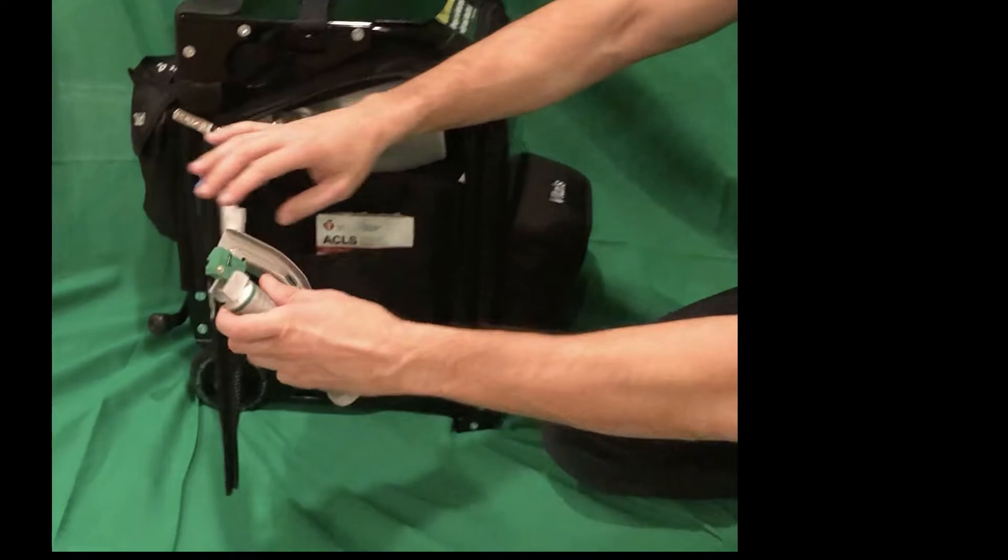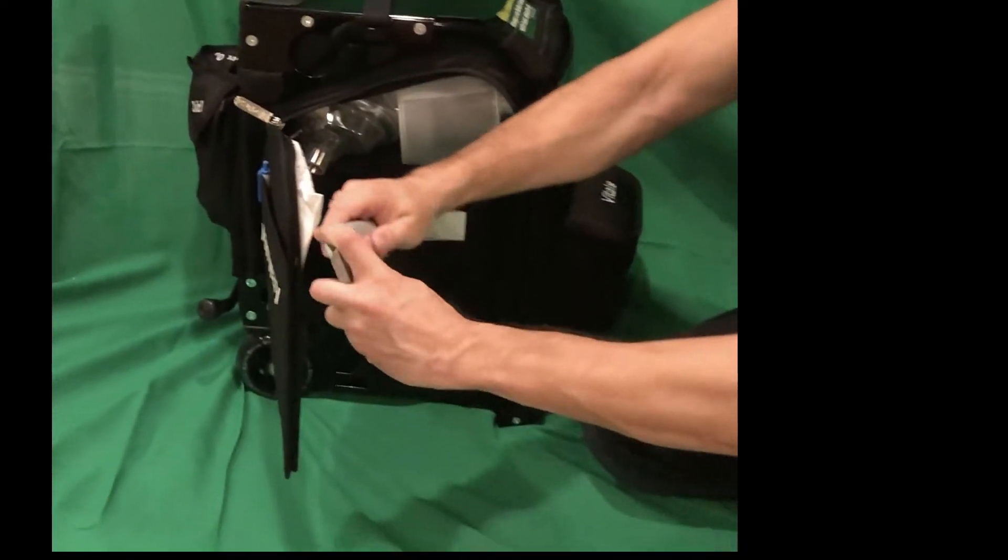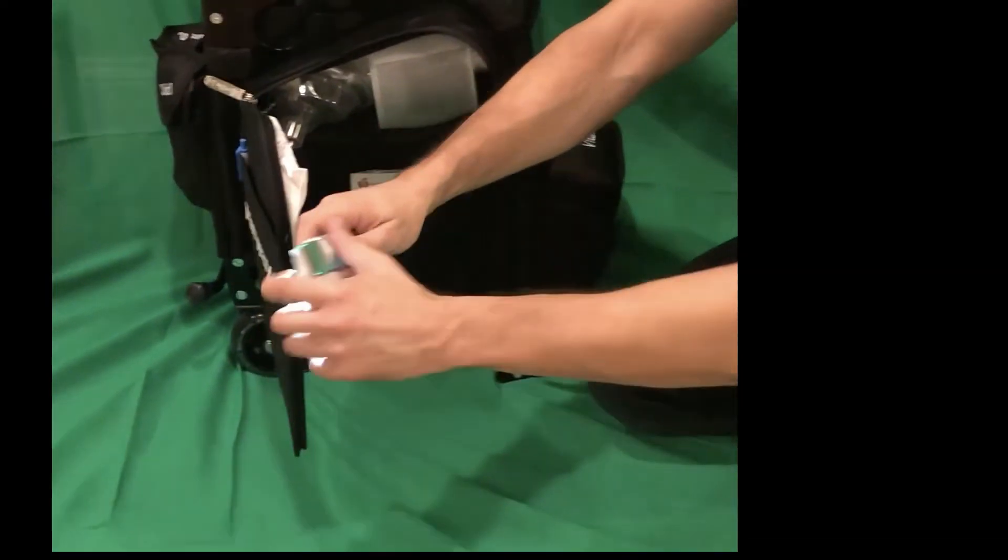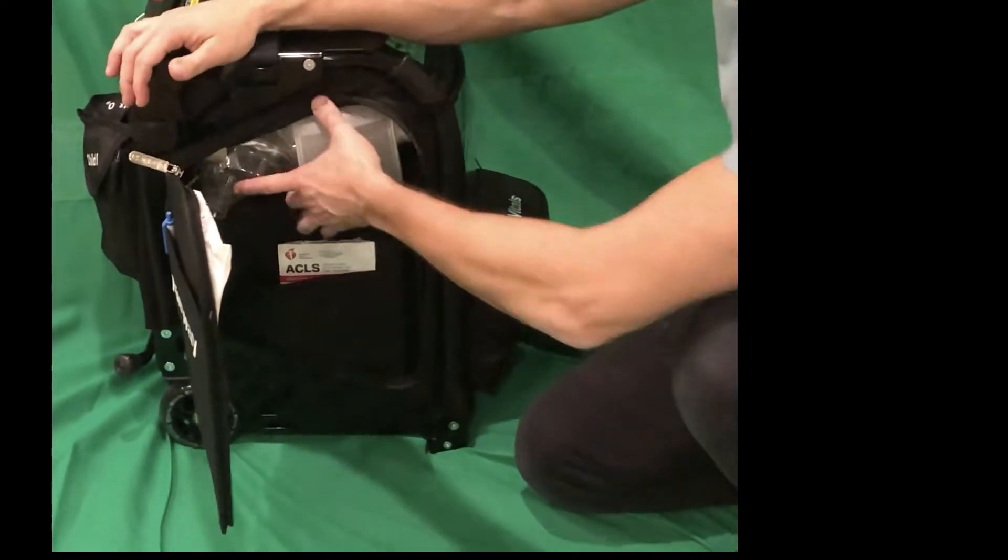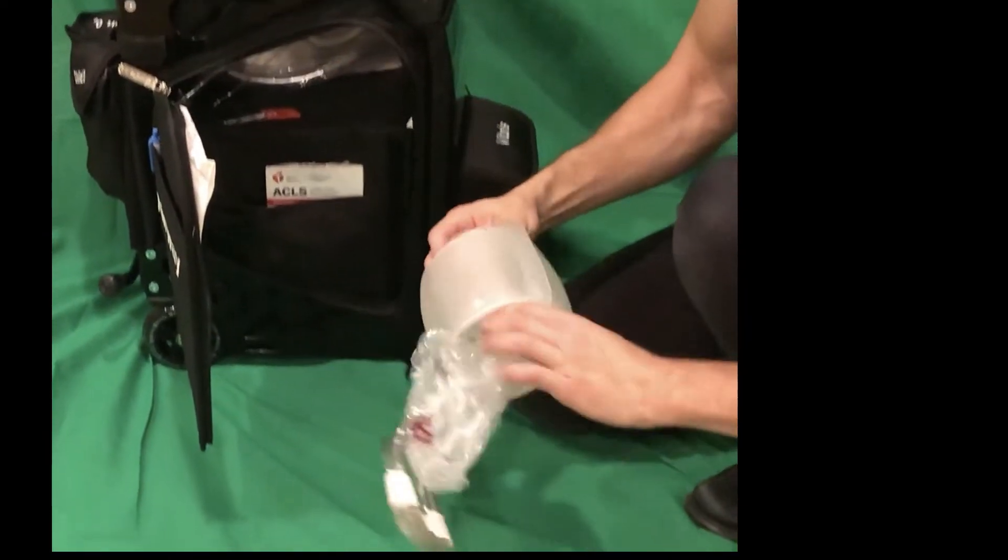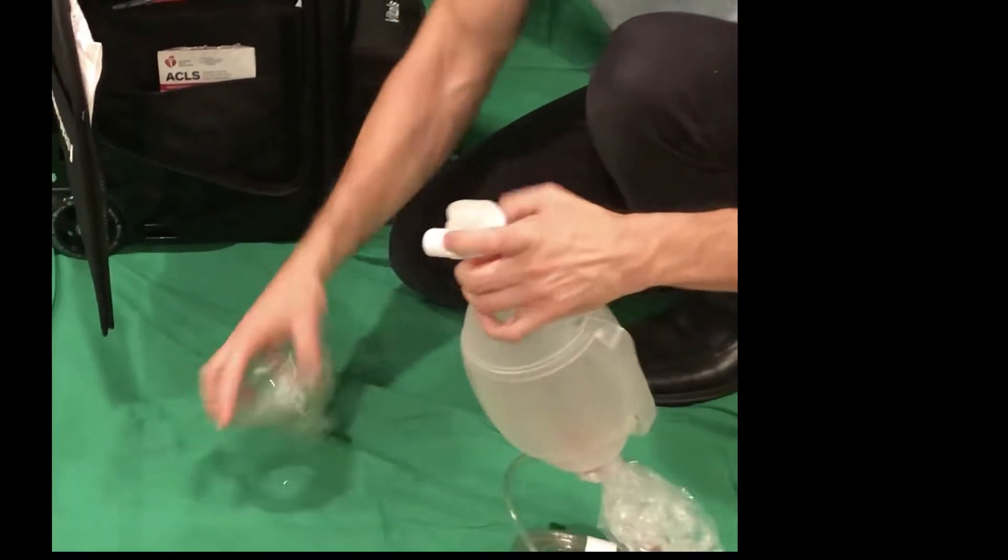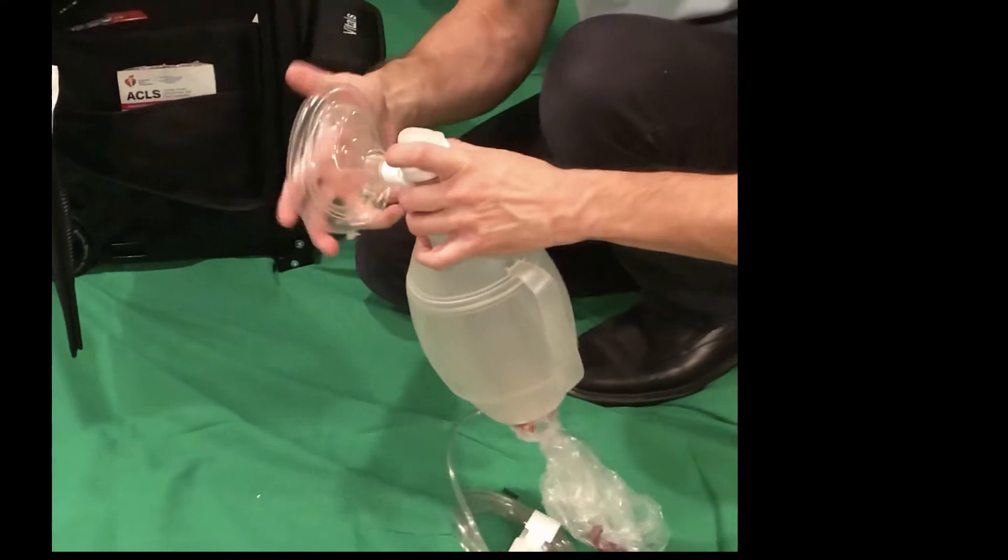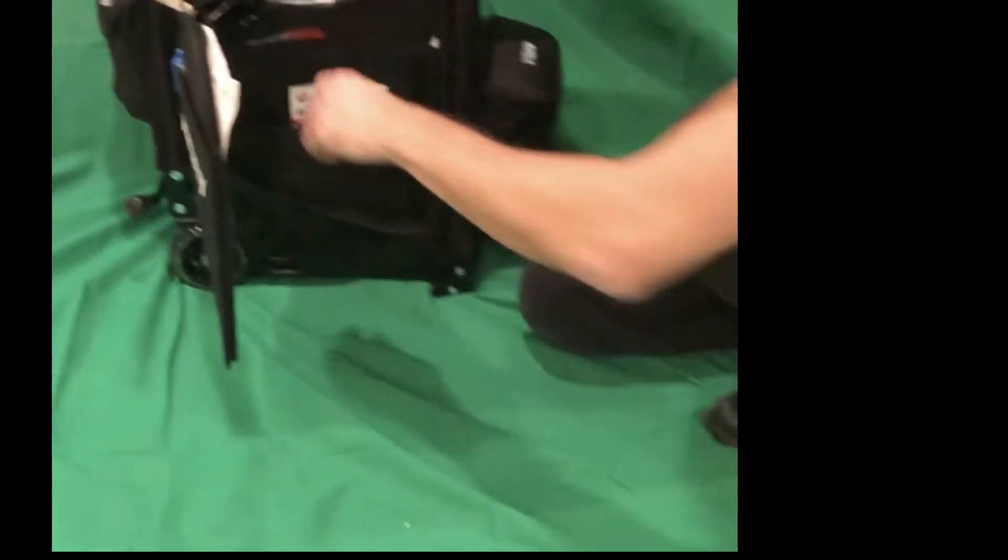We've already got the laryngoscope blade in the handle. It's out and ready to go. Next, if we want to ventilate for somebody, we have an Ambu bag with multiple masks. I already have the adult mask on that.